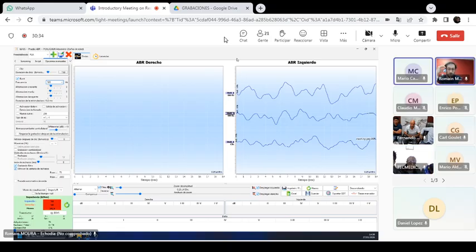But are you talking about ABR or audiometry? We need to double check with the tender requirements, because I think the unit supplied from EcoDR is taking care of ABR, ASSR, and so on, this kind of assessment.